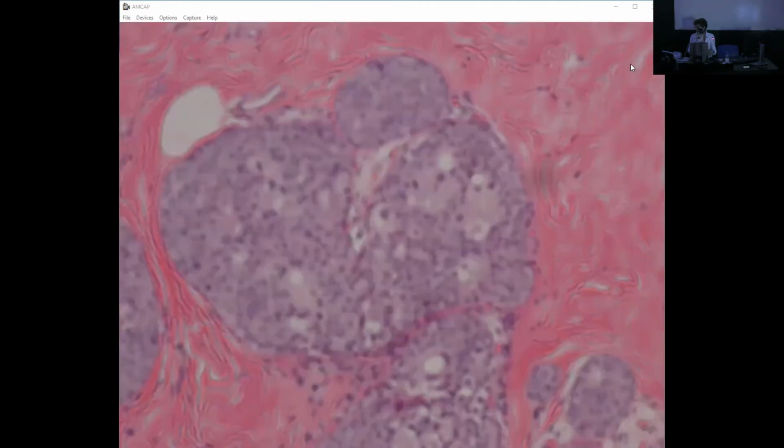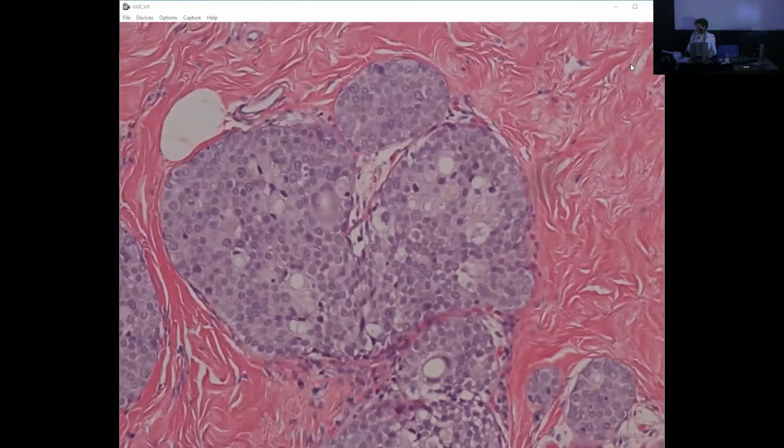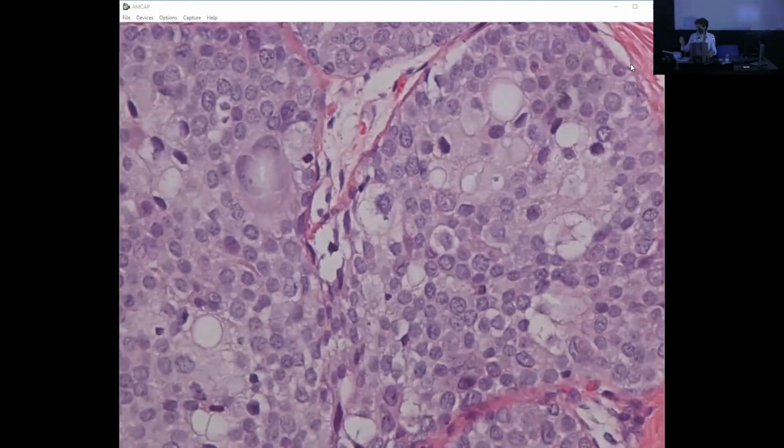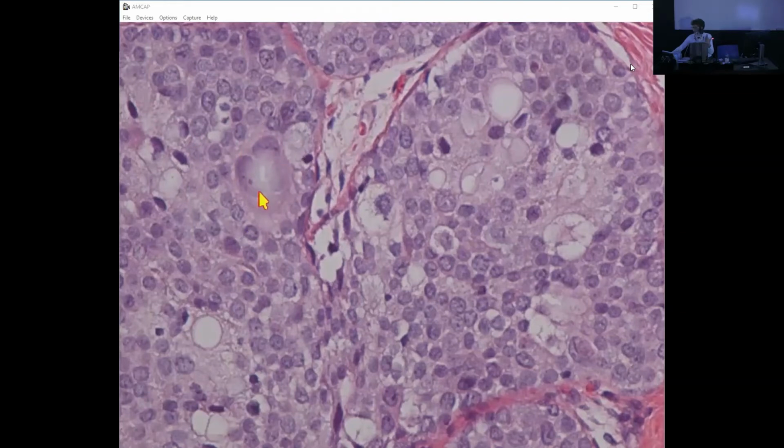Let's see what's going on here. Some cells very focally have a little bit more cytoplasm, right? It's almost like an intracytoplasmic mucin. And then there are some very bizarre looking cells growing here. So far, I wouldn't change the diagnosis of florid LCIS based on these bizarre cells.